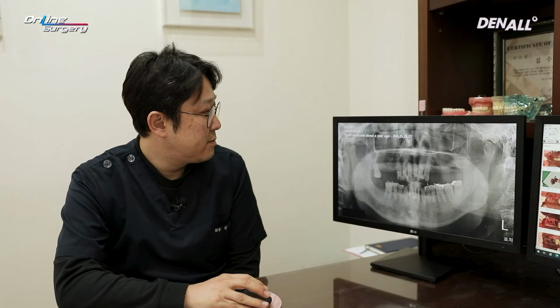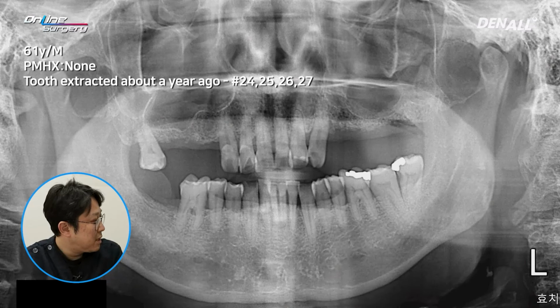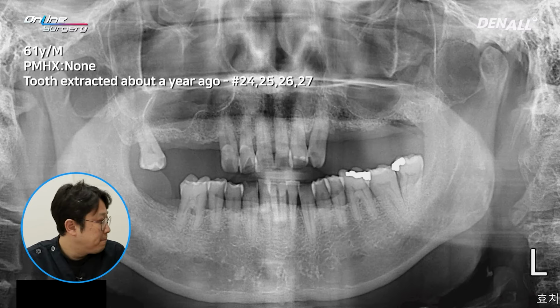Today I want to talk about a case where I placed implants through crestal approach. Let's look at the patient image at the initial visit. The patient is a 61-year-old male, and numbers 14, 15, 16, and 24, 25, 26, and 27 are missing.